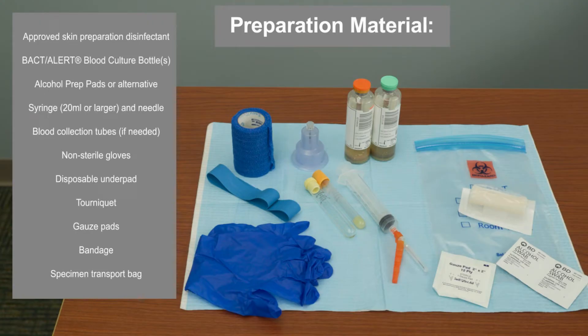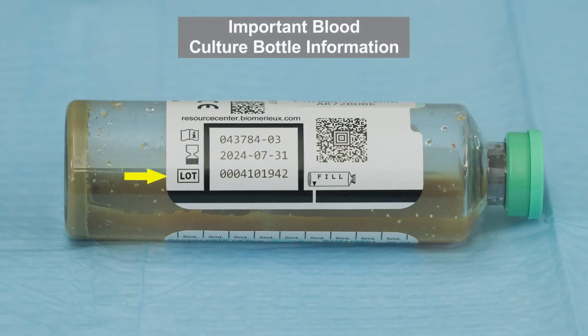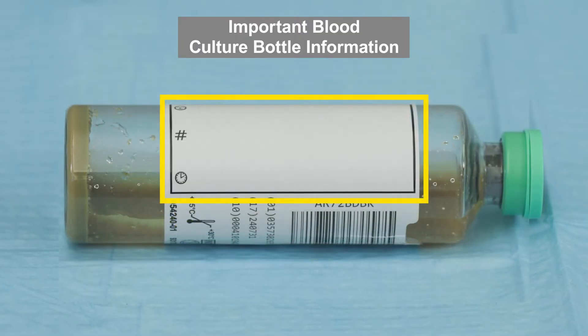Gather all necessary materials. Bottle lot number, expiration date, fill to mark, barcode, black box, window for checking the level of blood, area to add patient information, and test label.